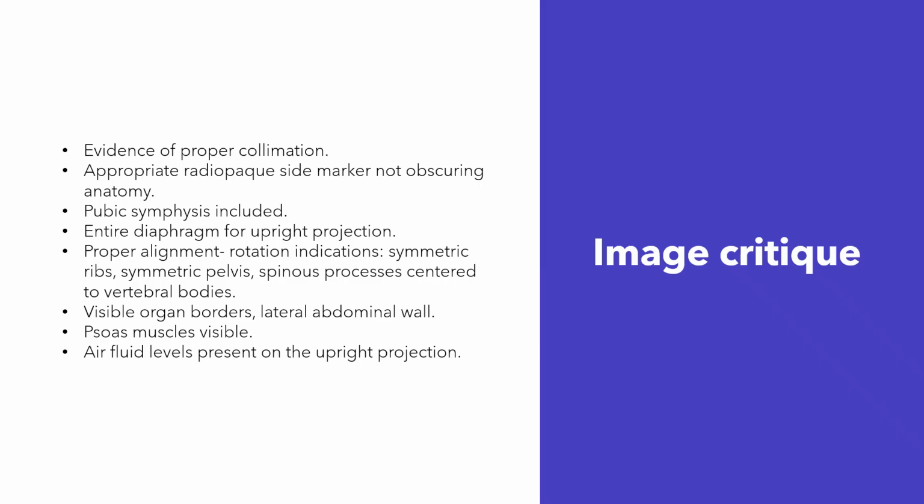Do we need stem to stern, or do we only need to get up to the top of the kidneys? Okay. For the upright projection, sometimes it's all the way to the pubic symphysis, sometimes it's diaphragm and as much of the anatomy as you can include inferior to the diaphragm, but don't clip off any of the diaphragm.